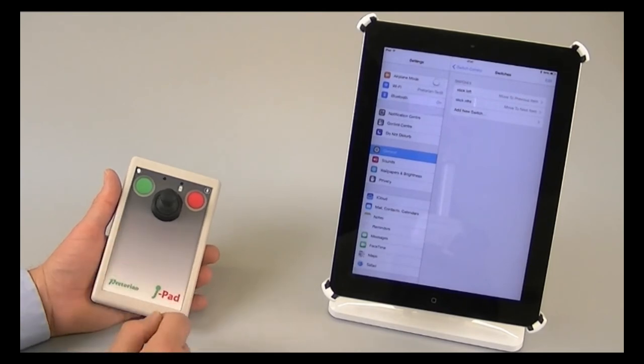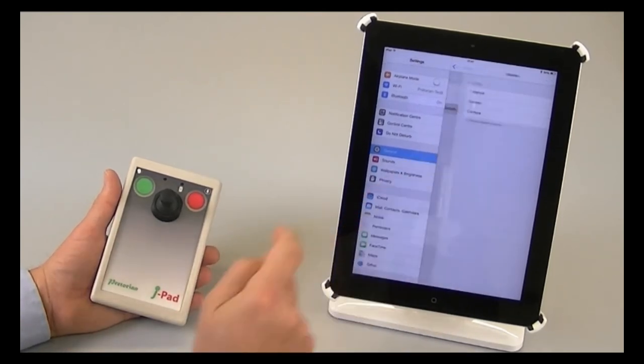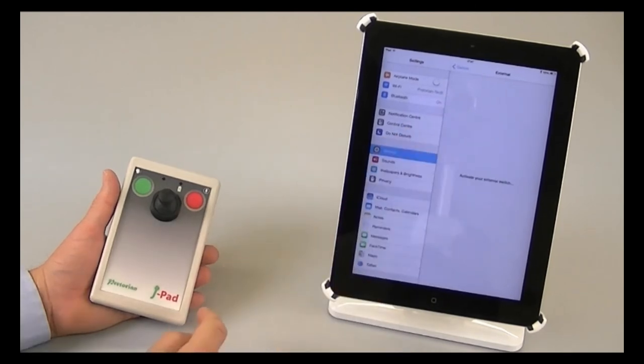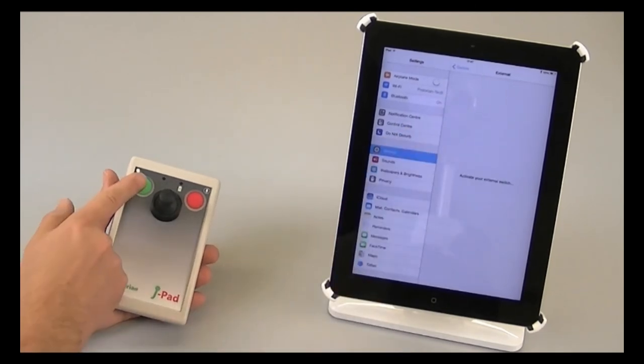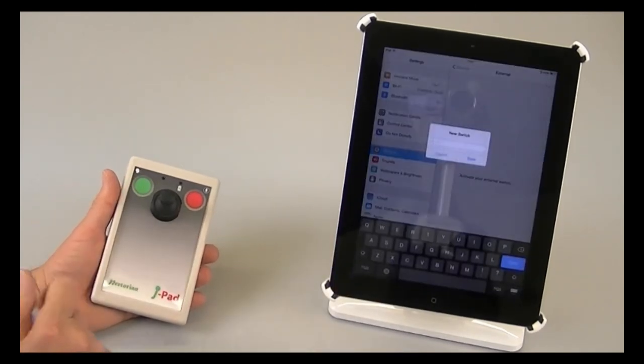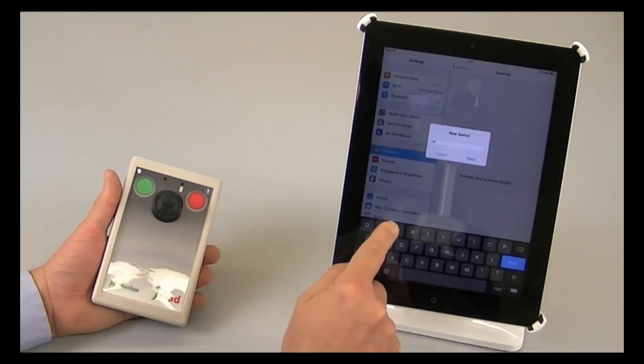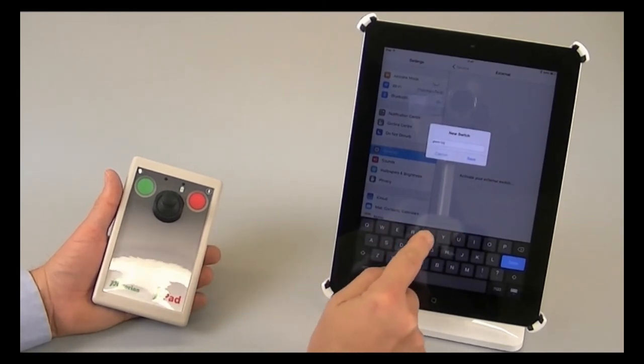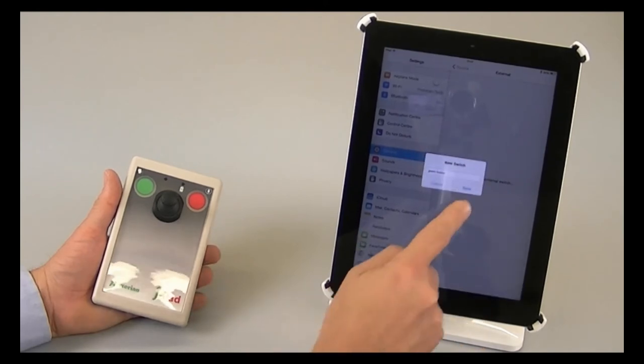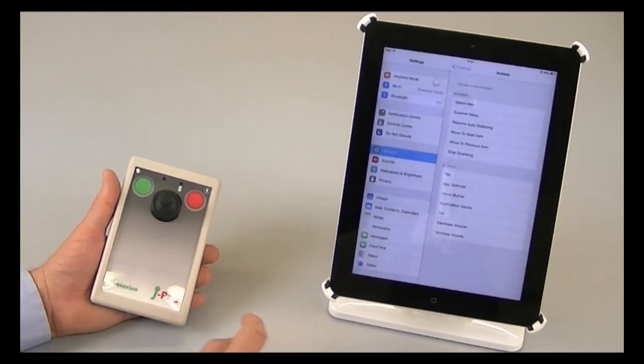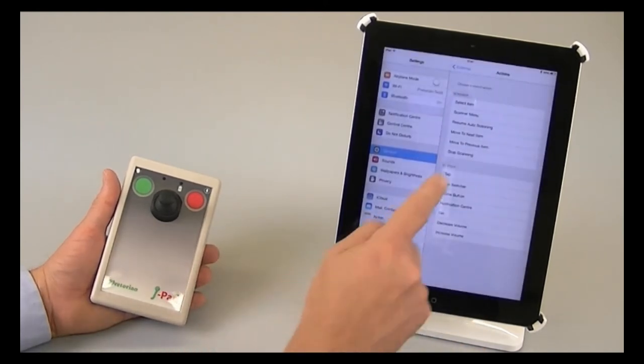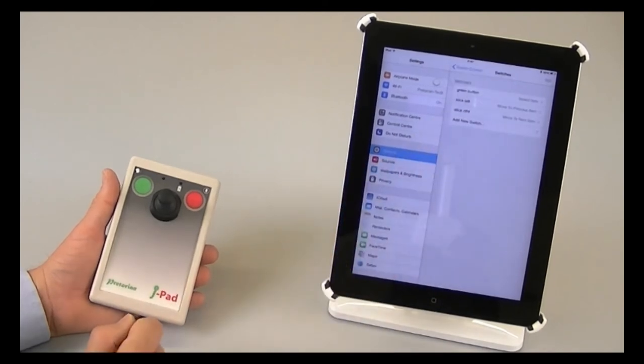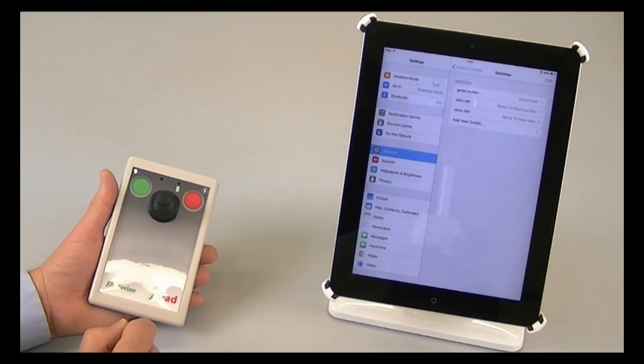Lastly, I need to set up the green button. Add a new switch, external. Press the green switch. And now type in green button. And I'm going to assign that to the function select item. And that is all I need to do to set up J pad to work on iPad switch control.